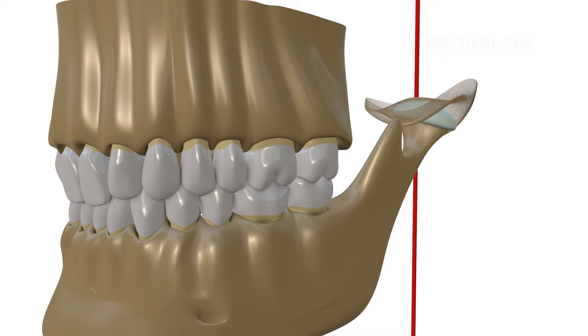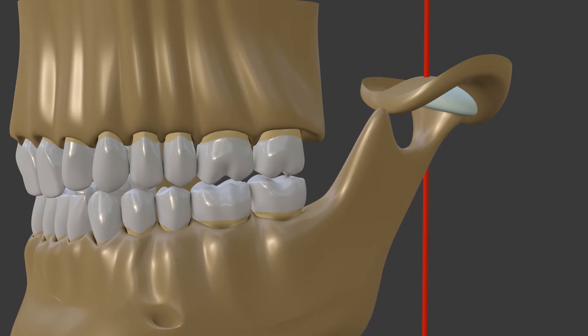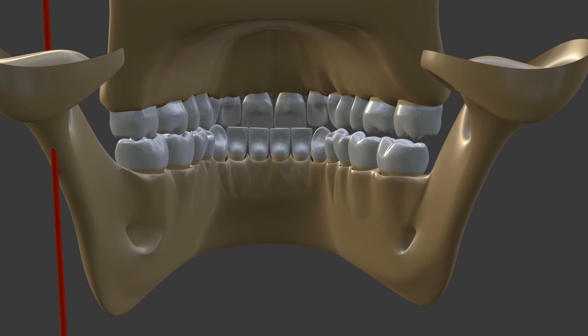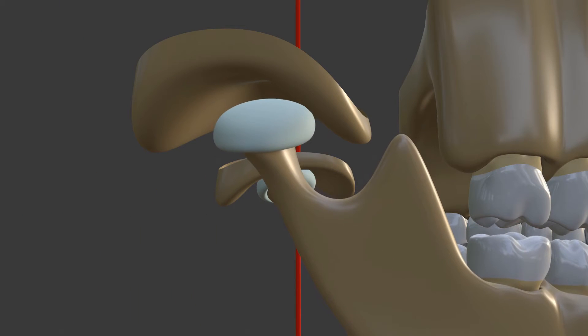The mandible makes a vertical rotational movement on the working side condyle axis during lateral movements while completing the chewing cycle. Meanwhile, the balancing condyle makes a forward, inward, and downward movement. The chosen articulator should mimic this movement.